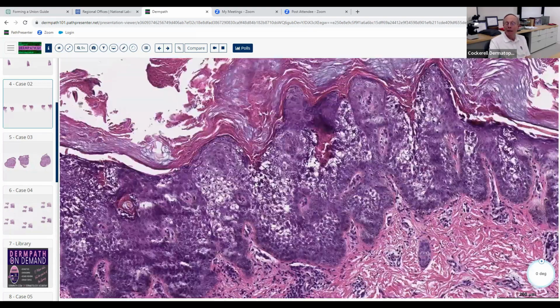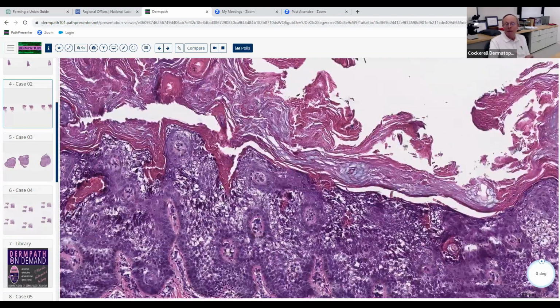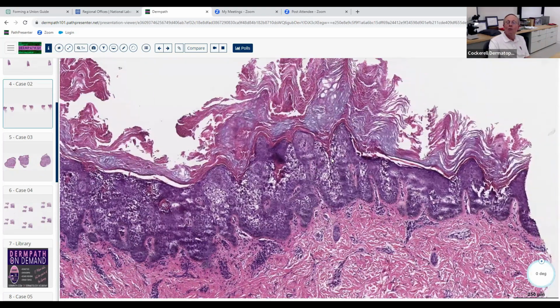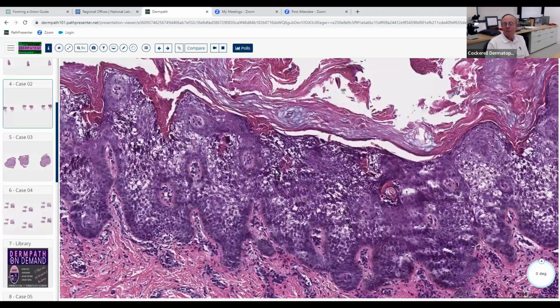Now, the good news about that is that you can recognize it pretty quickly. And then you've done that part of it. The not so good news is that they're going to ask you some questions about where you can see this reaction pattern. That's what they call second order questions. So they pop this on the slide and they say this condition may be seen in which of the following disease states or something like that. So you have to look down at your multiple choice questions and see which ones are there. So what are some of the things they're going to write in there where you can see this reaction pattern?